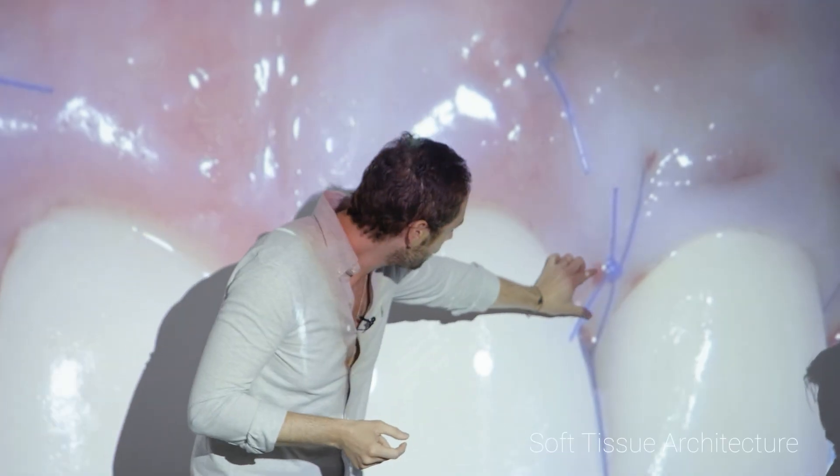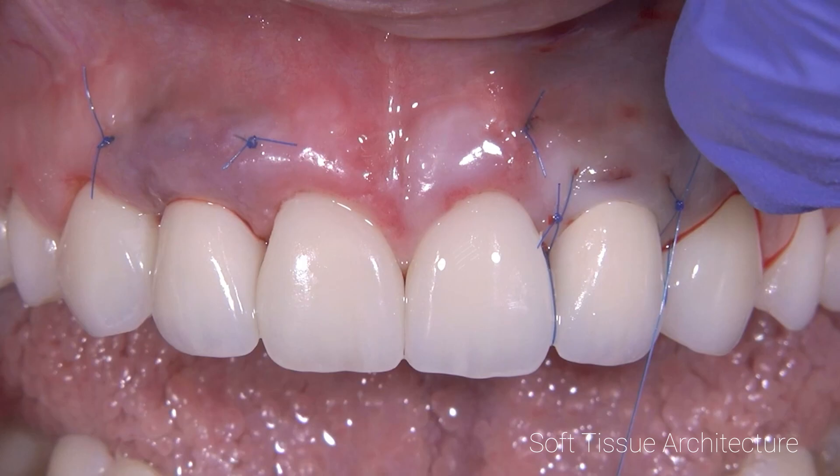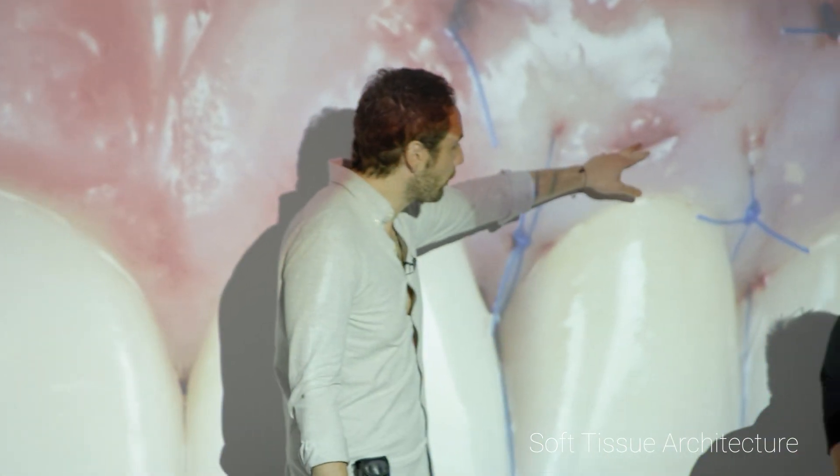I really only need this part here — everything is mobile. The blade works better for me here, because if I go with a tunnel instrument it's not easy to go total, and sometimes you just cut the papilla and then finish like that.